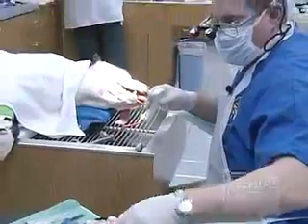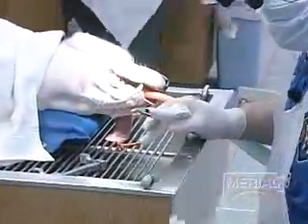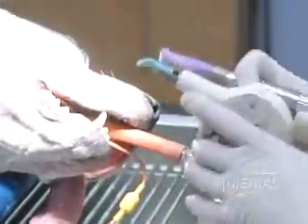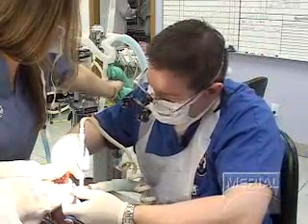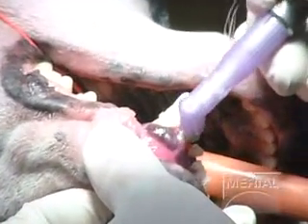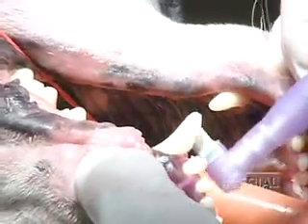The next step is the Orivet. It's very important to have the mouth completely dry, as it allows the product to bond to the surface of the enamel. This is a plaque prevention treatment that is followed up with home treatments done on a weekly basis. The Orivet is placed into the gun and I like to polish it into the surface of the tooth. We normally treat the outside of the teeth, unless there's significant tartar buildup on the inside, in which case I'll apply it there as well.